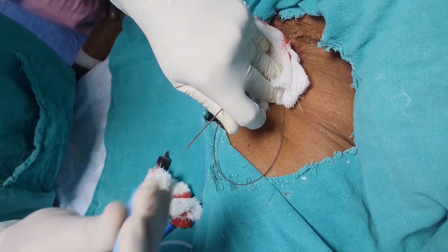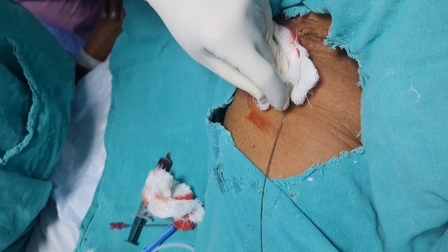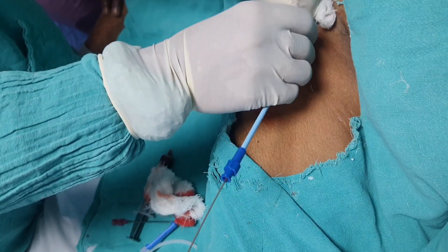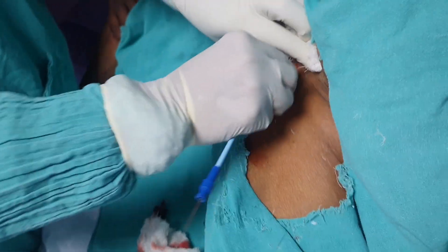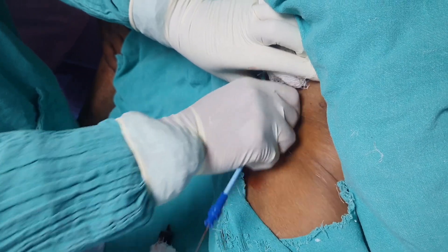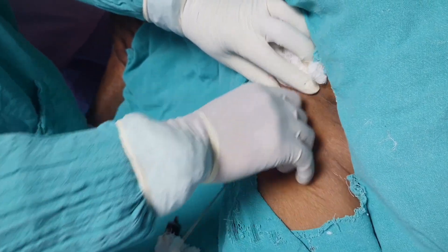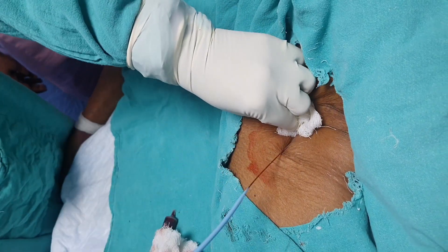Now we will dilate our insertion site using the dilator which comes along with the dialysis set. We have to push hard in a rotatory manner and insert by 4 or 5 cm inside. So now we have dilated enough.